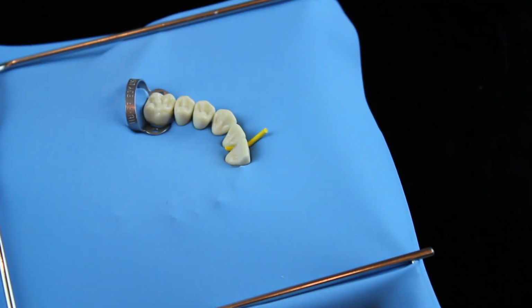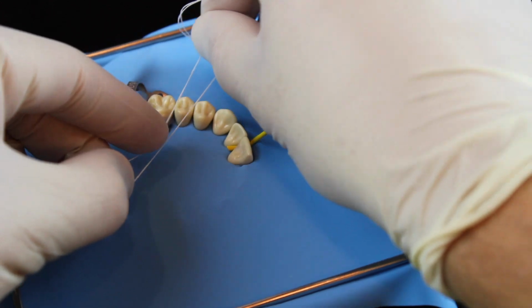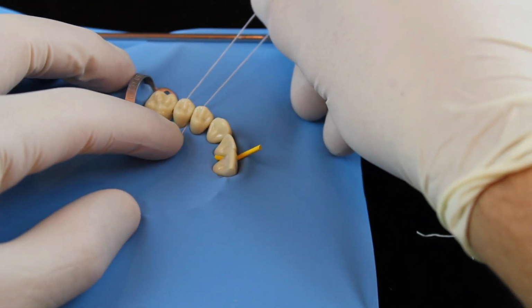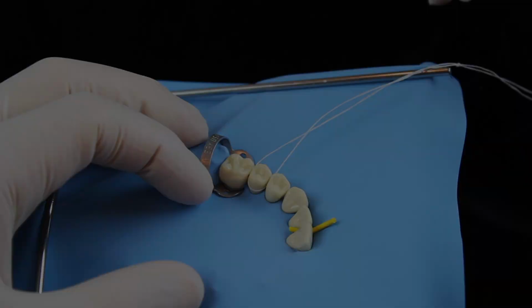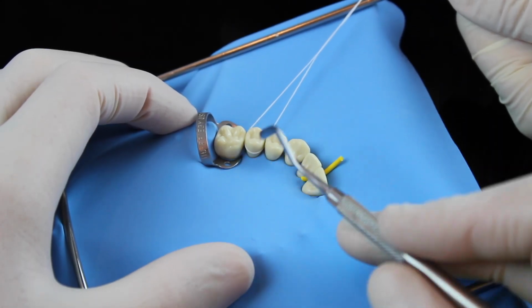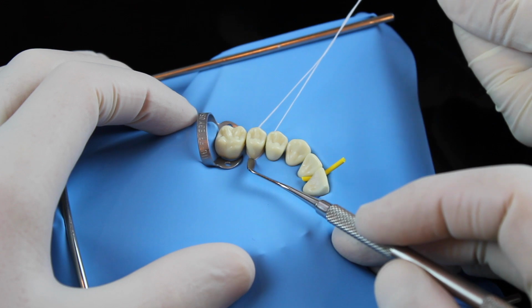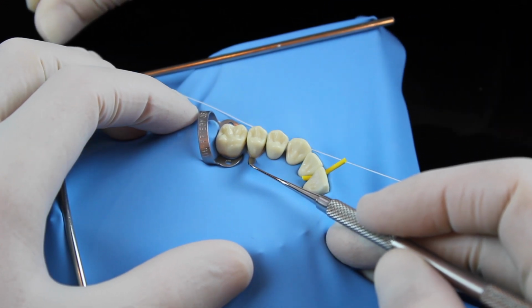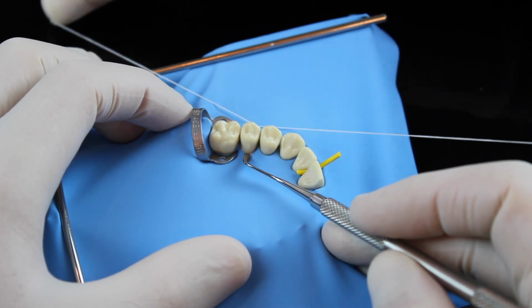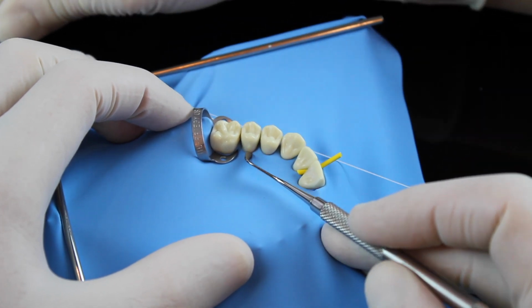And now the same thing from the parallel view. We keep the floss under the equator with the help of a flat instrument and tighten it slowly. By moving the knot left and right, we will push it further down.